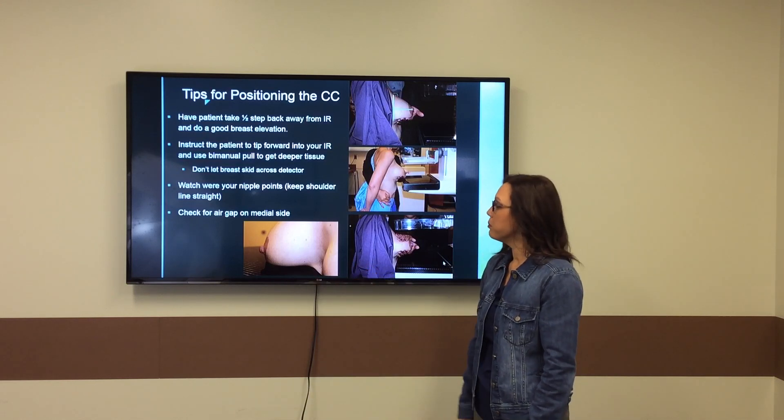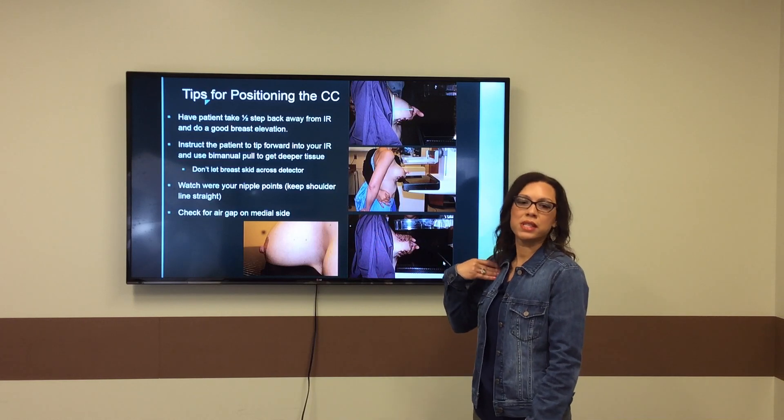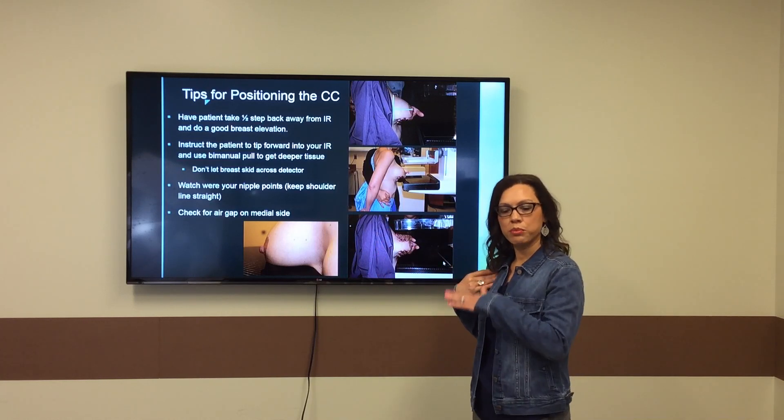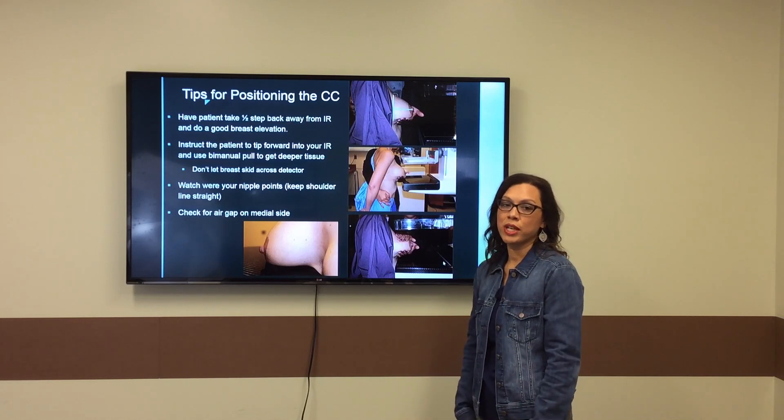From that point, you can begin to put your arm back around the patient, lift up on the skin right under her clavicle, bring the compression paddle down, slide your hand straight towards the nipple, and you should have a great beautiful deep tissue CC projection.